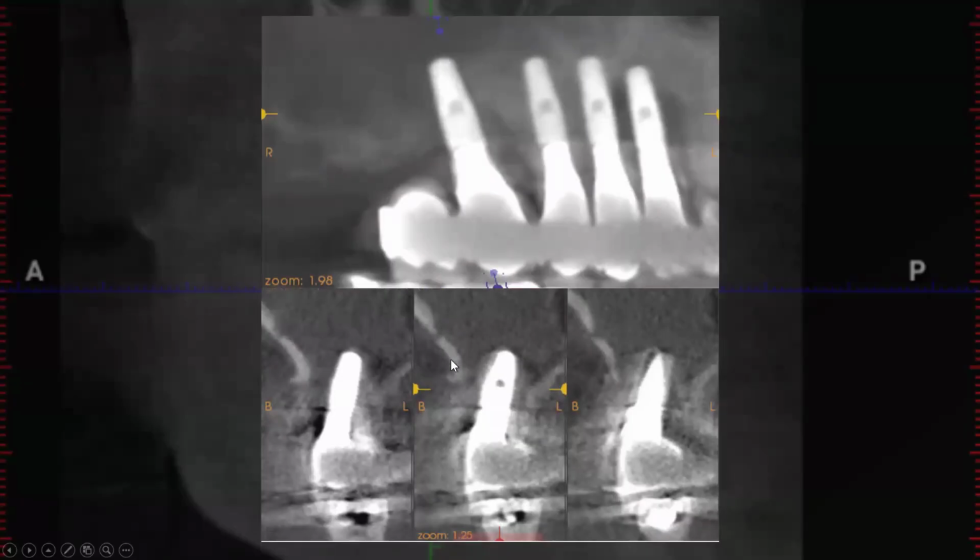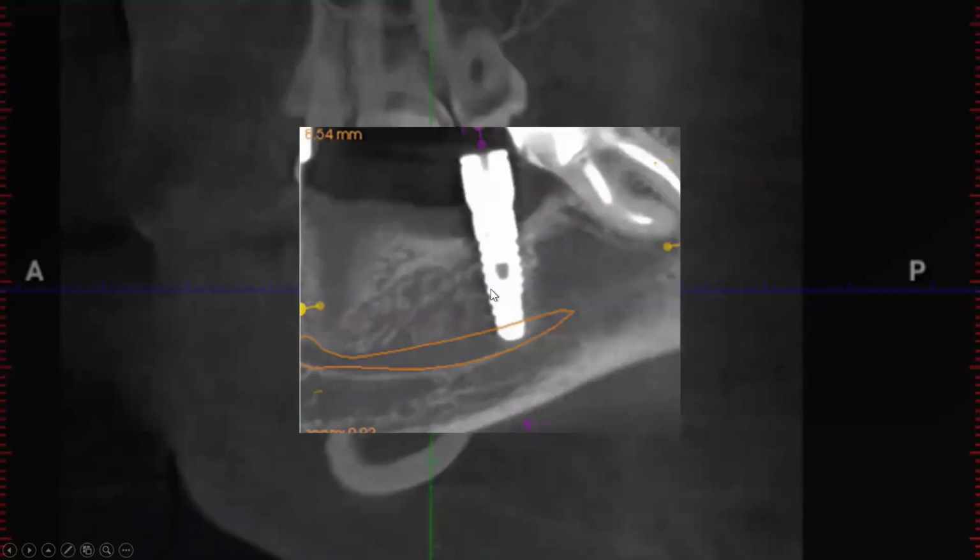See very sclerotic sinus borders. And see all this metal artifact, even around the implants, there's artifact. And so I mentioned the Achilles heel of CBCT being artifacts. If you ever have two implants right next to each other, you get what's called the beam hardening artifact, and it just basically makes that whole area hypodense. So it's really tough to see bone in between implants. But in this case, we had the pano as well. We could compare it, and there was just not a lot of bone there.